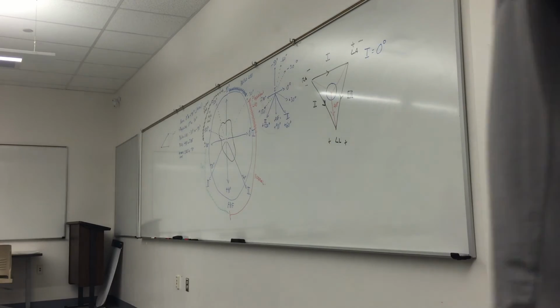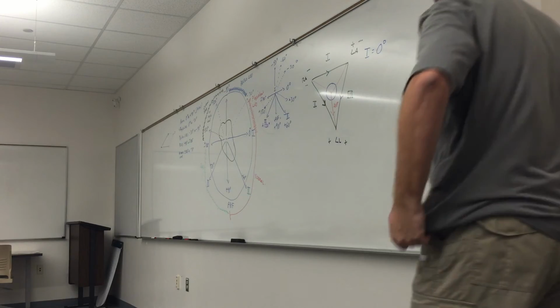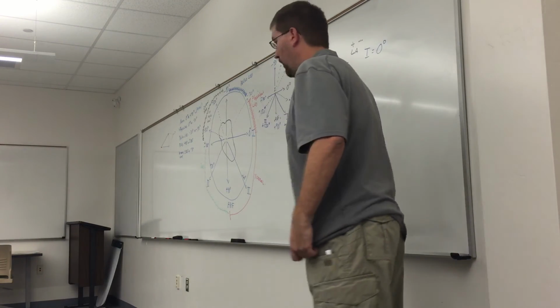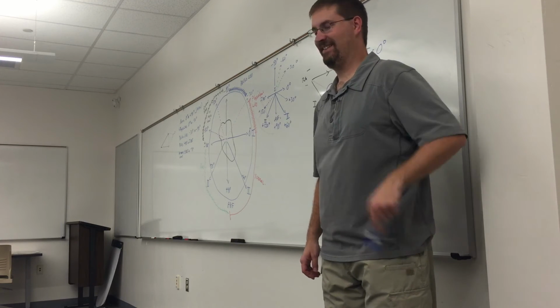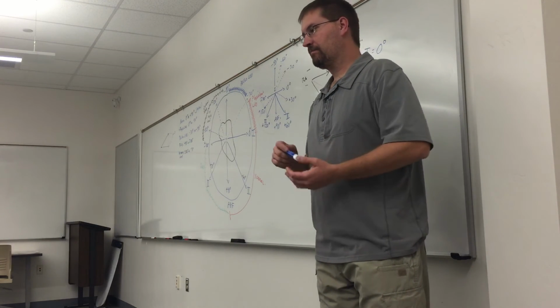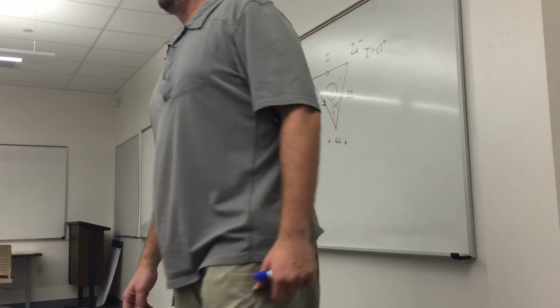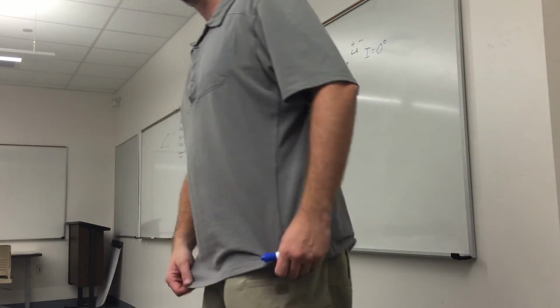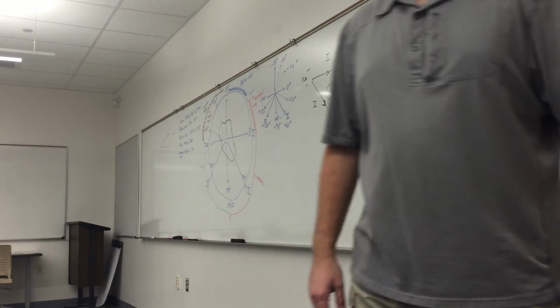And I will be talking about what causes right and left. I just want to make sure we're okay on how to identify it. All right. So I've got a 12 lead ECG there, and we have no idea what the axis is yet. You guys cool with that? So what we're going to do is we are going to try to determine the axis.